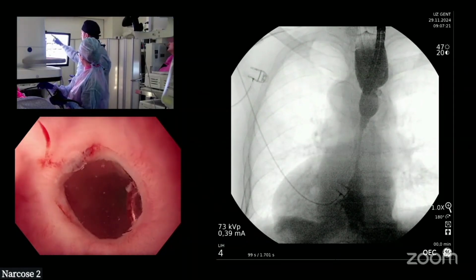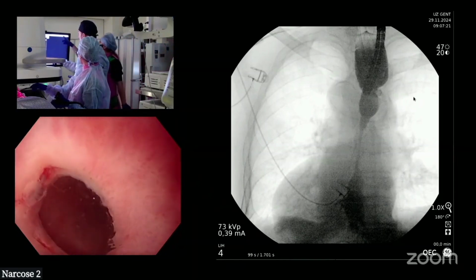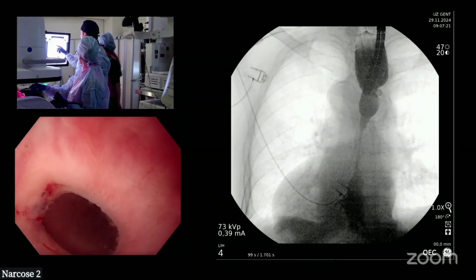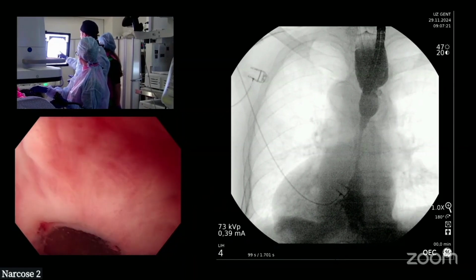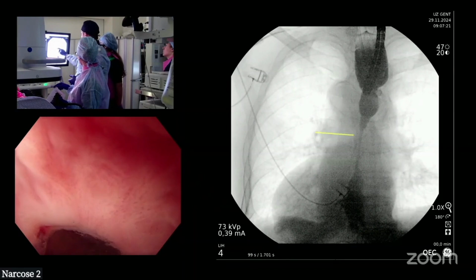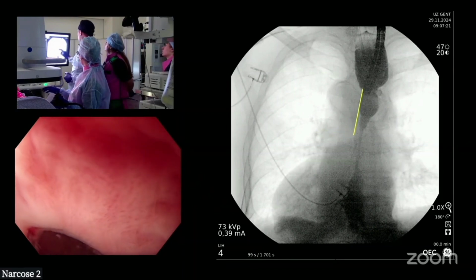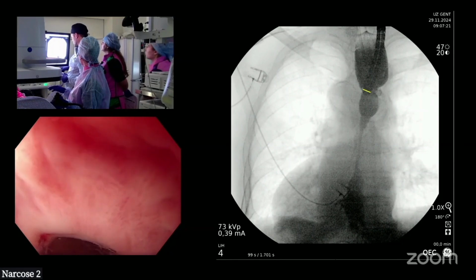Oh, we just don't know, do we? And I think I'm going to fail here to be able to do this measuring on this. Yeah, do it there, let's try it, okay. And then we have to do this, but I think we first have to calibrate. What is the tip of the endoscope? So just measuring the calibration here, this tip of the endoscope, I think is 9.1, we said. Have we got keyboard?